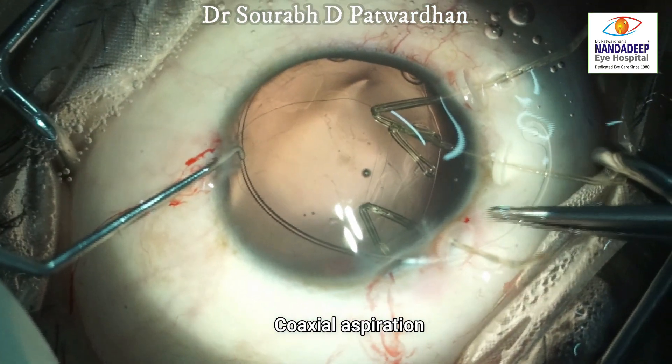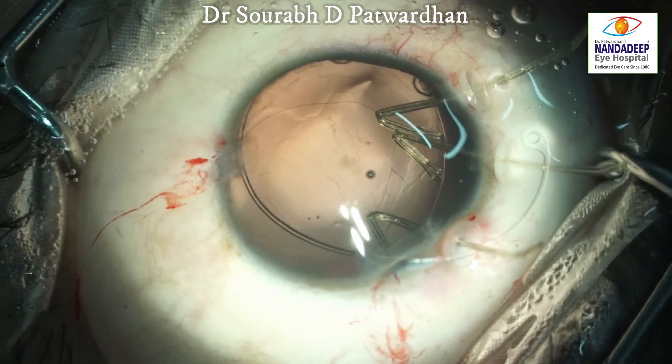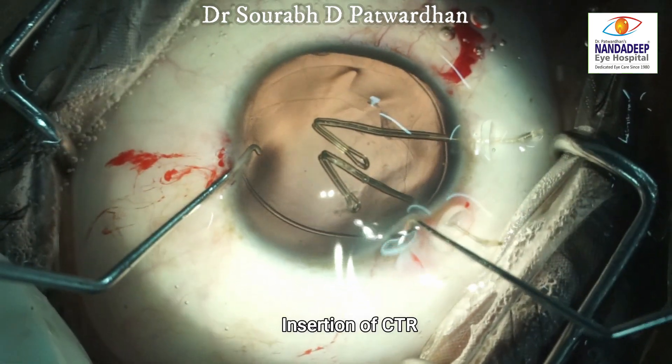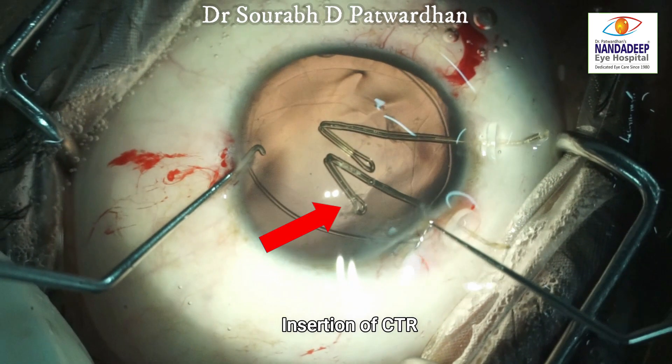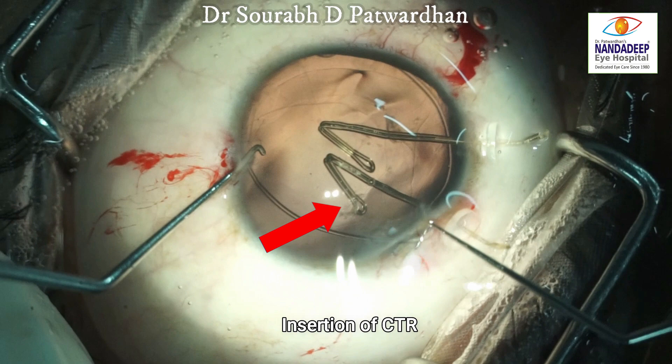This is a softer cataract, so I am just doing aspiration of the lens using the IA probe. Once it is done, I will be inserting CTR, and as it progresses I am removing the capsular hooks one by one so that the CTR doesn't get entangled with the capsular hooks.